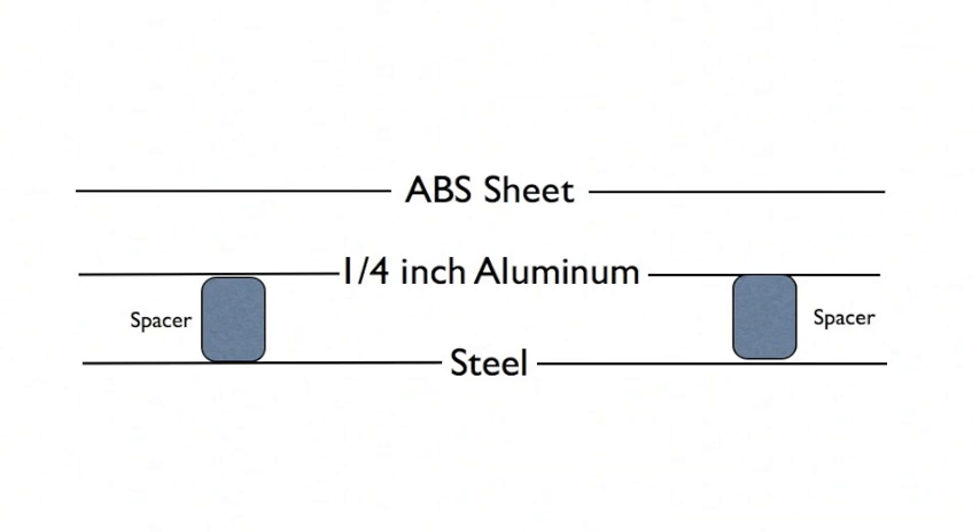The first layer of the stack is a thin sheet of steel. The steel provides a downward force to reduce vertical tremors and increases friction to help reduce horizontal tremors. On top of the steel, there is a spacer which provides the optimal distance between the steel and aluminum. The next layer is a sheet of quarter-inch aluminum — the most important layer in the stack. It provides variable braking resistance based on speed to reduce horizontal tremors. The final layer is a thin piece of ABS plastic, which provides a nice surface for the MagRite to glide on and protects the aluminum.